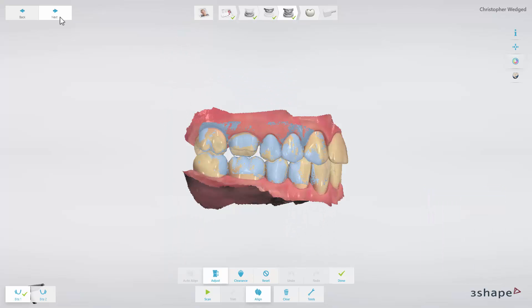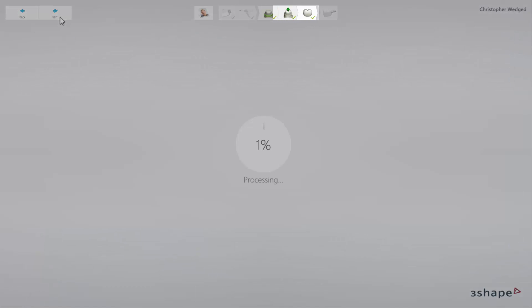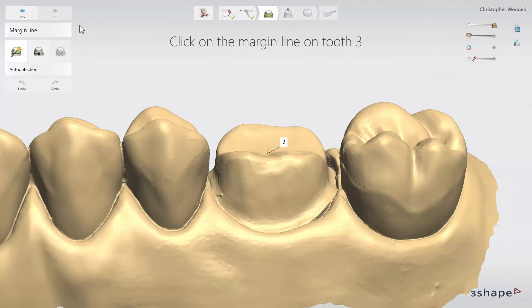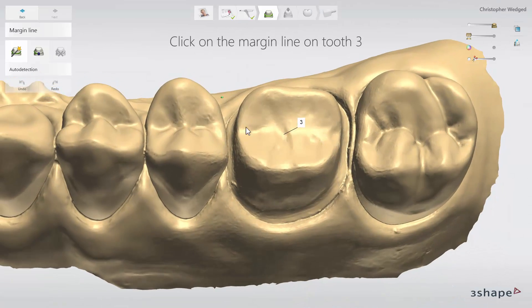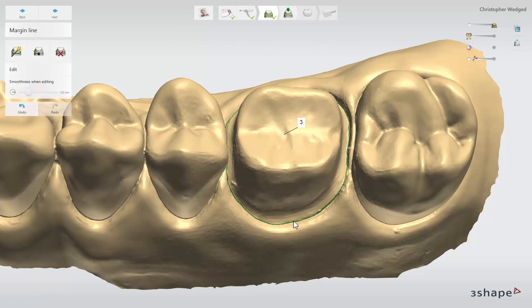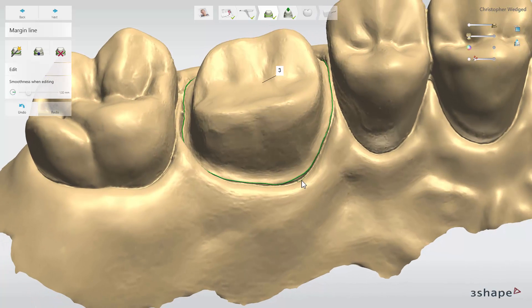When all the necessary scans are ready, click Next to move on to Crown Modeling. The icon will now divide and show all the design steps. Start with the Margin Line step. The margin line is automatically detected once you initiate it, but it can also be manually adjusted.